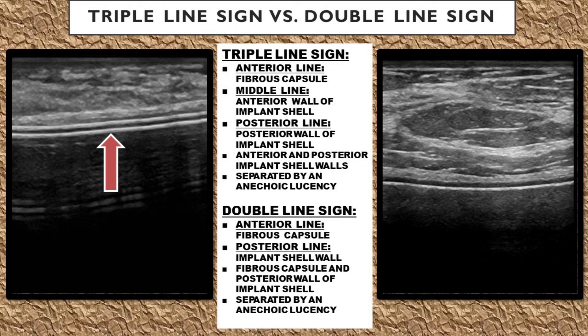Both the triple line sign and the double line sign are considered normal variants on ultrasound, and it's purely based on how the implant is manufactured and how the ultrasound machine picks up the shell wall of that specific implant.